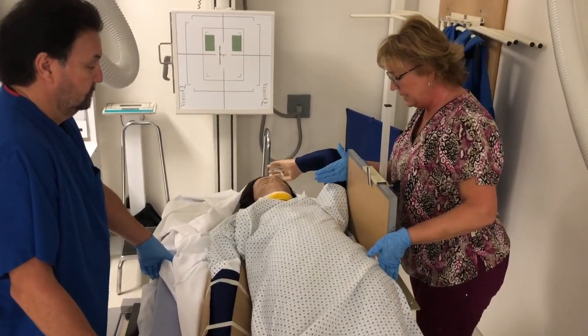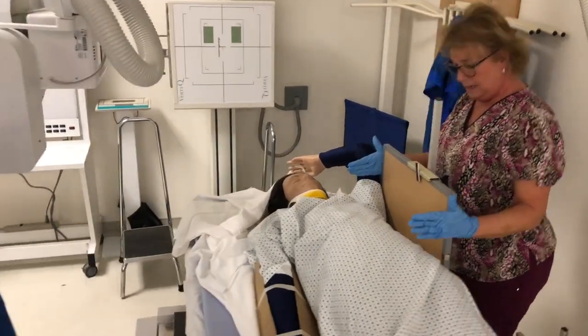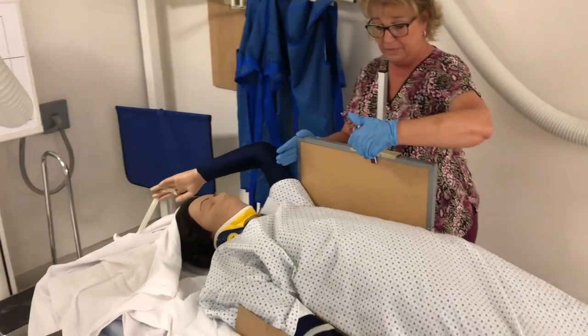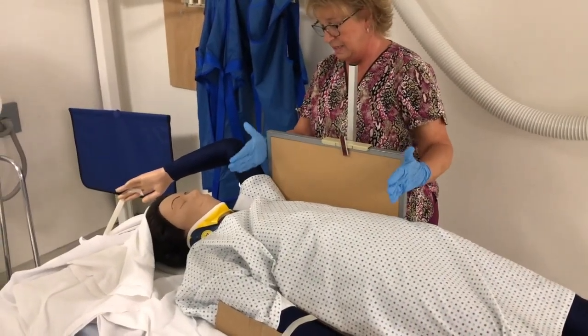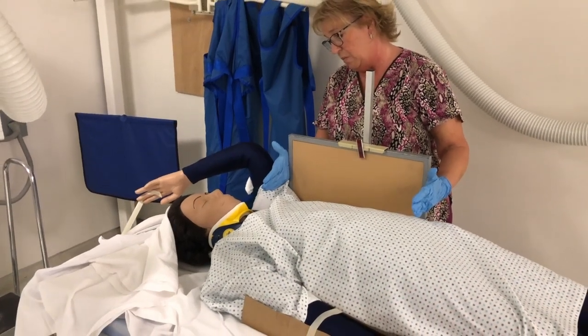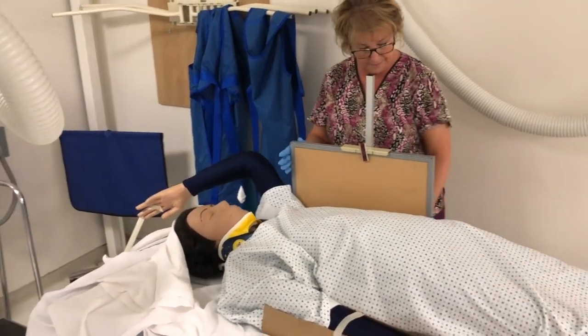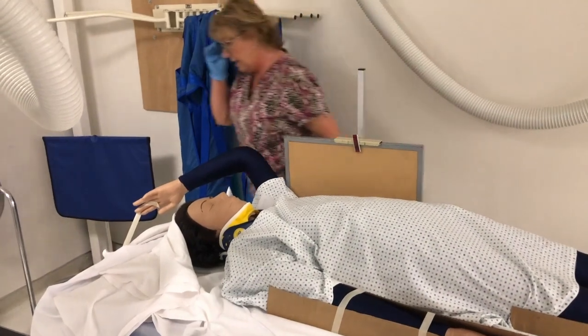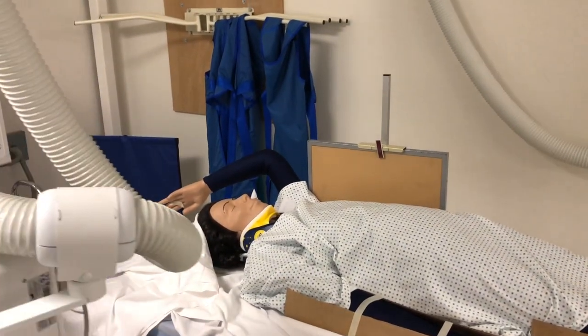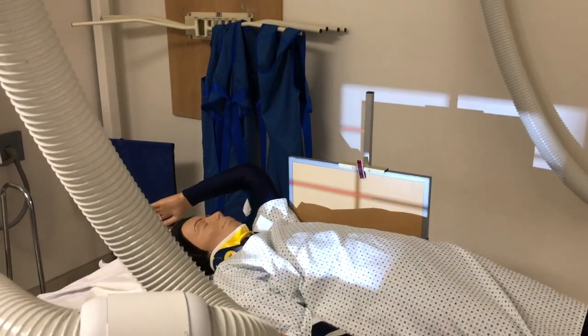So for the thoracic spine, positioning wise, again, I want to come in around the level of T7. So I'm placing the upper border of my IR about even with her shoulder. Okay. Try to get 40-inch SID.